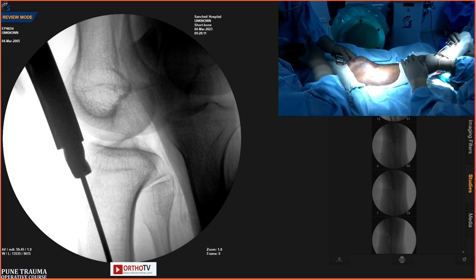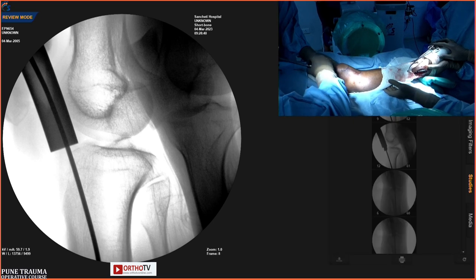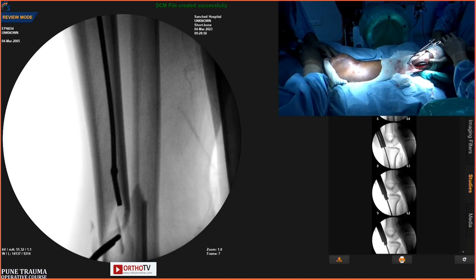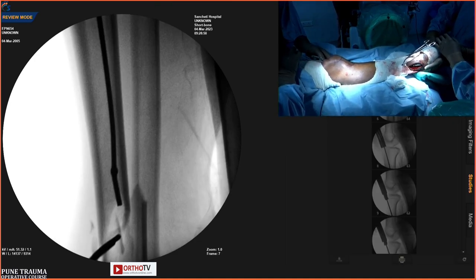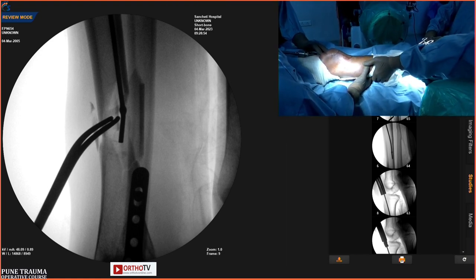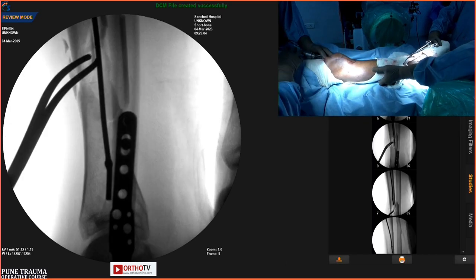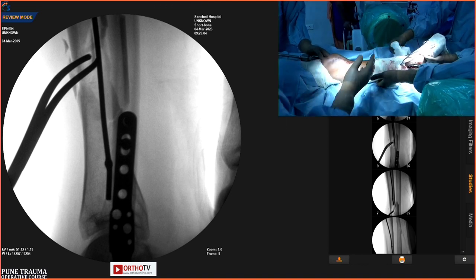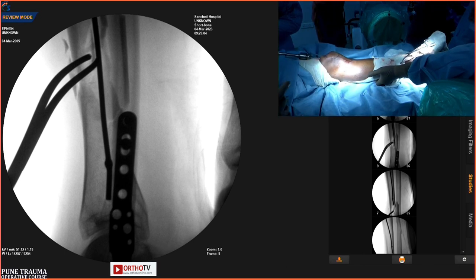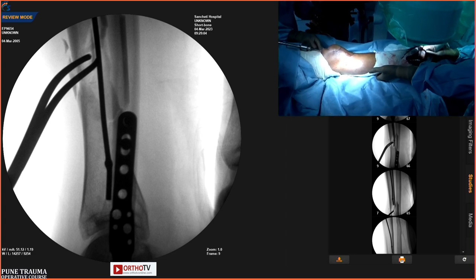Now there is a recurve. Can we put a transverse wire before putting a guide wire or reaming, to place a reamer more anteriorly? Now we have to check in the AP also. Hammer test.